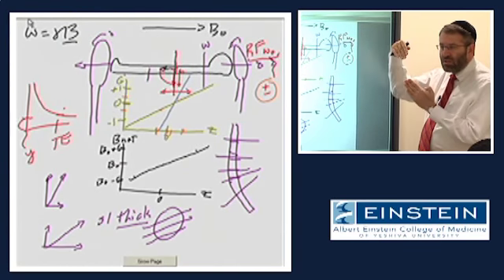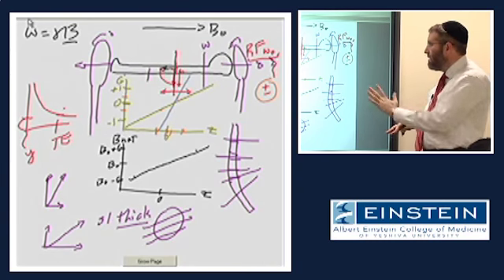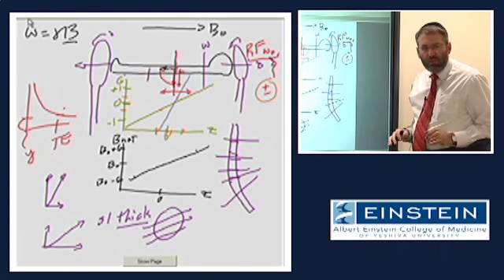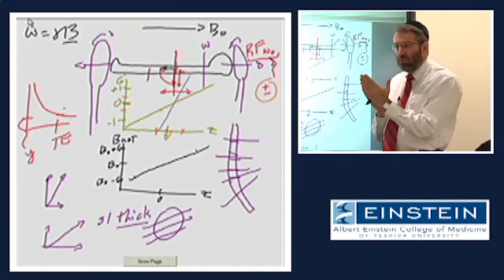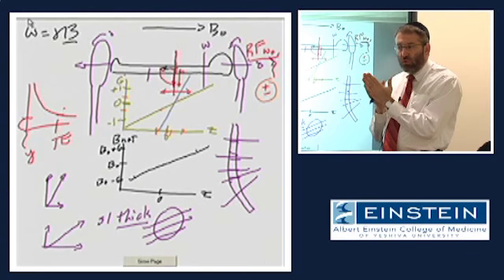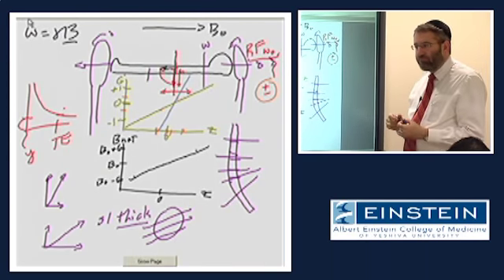So by increasing the slope of the gradient magnetic field, everything else staying the same, not having to do anything with the range of frequencies that we transmit our RF at, we can narrow the slice thickness. And of course, if you flatten out that gradient magnetic field, you can do the opposite.